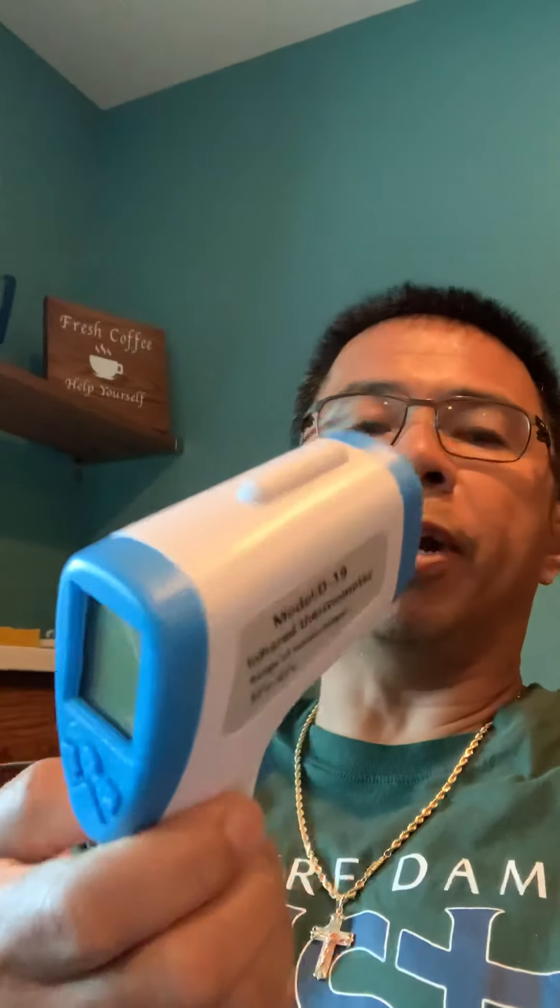The first thing we did was clean the packet that we received because it came from China. So of course we cleaned it and made sure that it was safe. When we opened the package we had this wonderful device — and I want you to understand that it is battery operated.